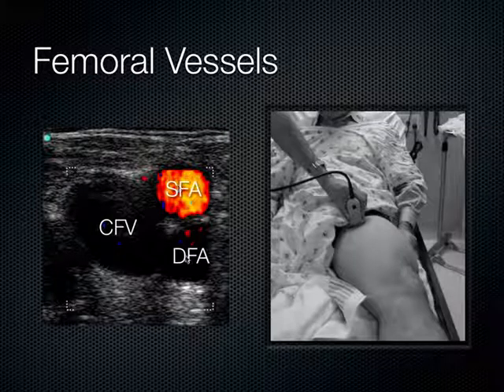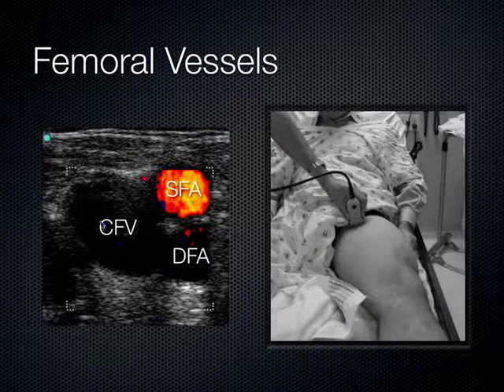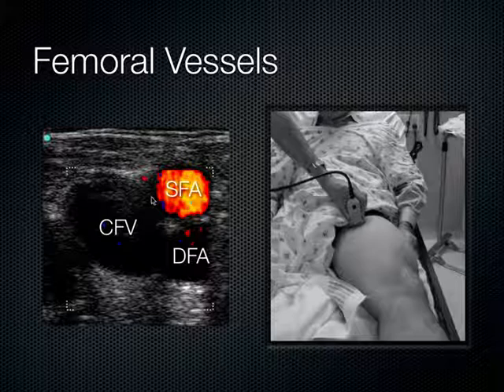Here's the superficial and deep femoral artery. Here's the common femoral vein prior to compression. This is the left leg. We aim the indicator to the patient's right. This is medial. The way I remember that the veins are medial to the artery is that venous rhymes with something more medial, penis, venous penis. It's closer to the penis, and that's my way of remembering. I know there's other less vulgar ways to know this, but this, for some reason always helps me out when I'm on either side of the leg and trying to decide which side I'm on.